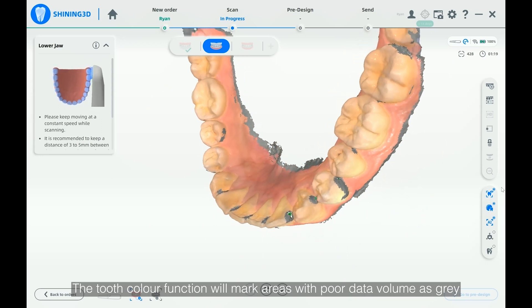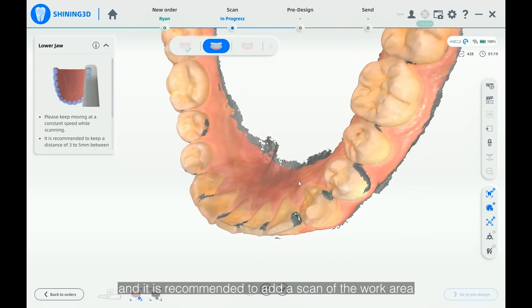The tooth color function will mark areas with poor data volume as gray, and it is recommended to add a scan of the work area.